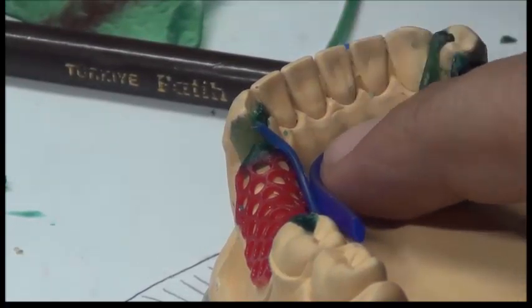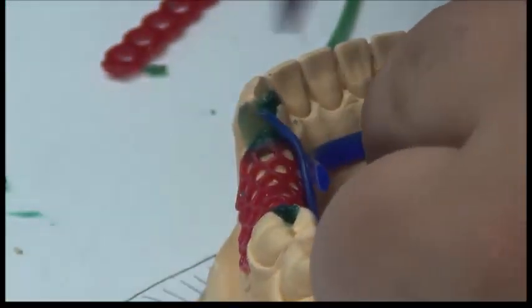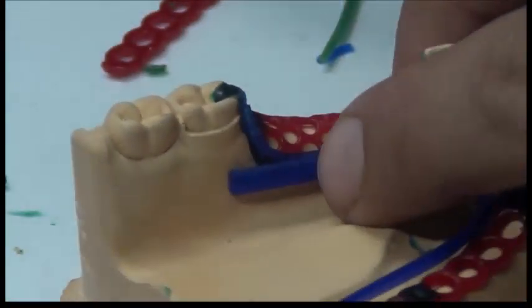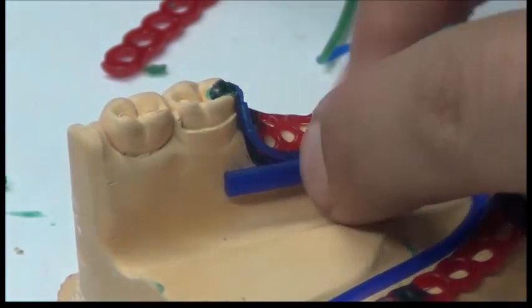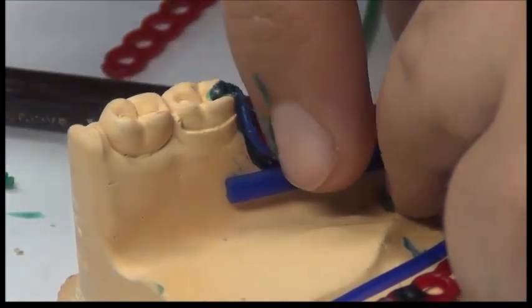How much do I keep it away from the marginal gingiva? 4 millimeters from the marginal gingiva, the upper edge of it. Okay? And then I cut it, I stop it at the external finish line here. So, the bounded area finish line extends along the whole length of the external finish line of the bounded saddle area. Okay? Adapted lingually. It stops at the external finish line at the free saddle area.